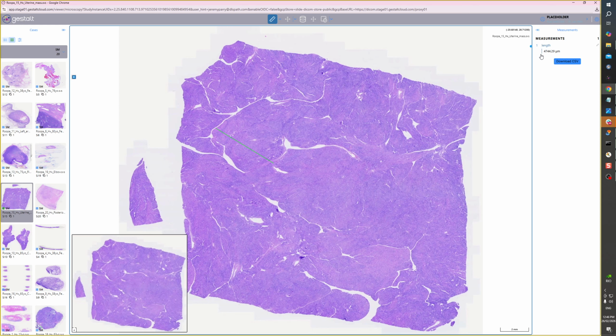The length is here, so that's in microns, so that's 4.7 millimeters. But you can change the name as many times as you like with that function. You can download the dimensions and coordinates of the annotation as a CSV file here, and if you do that, it'll create a separate tab underneath the main image, and that will store the annotation data. I won't do it for now, we're just perfecting that little function.